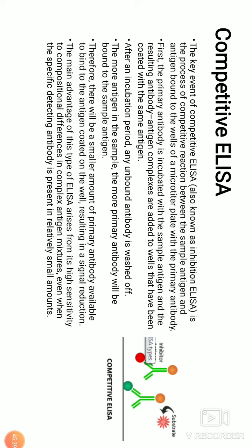Coming to competitive ELISA. Competitive ELISA provides another extremely sensitive variation for measuring amounts of antigen. In this technique, the antibody is first incubated in solution with a sample containing antigen. Remember this: there is a pre-incubation of the antibody with the antigen to be measured. Now, whatever the concentration is, antigen and antibody are already bound. The antigen-antibody mixture is then added to an antigen-coated microtiter well.